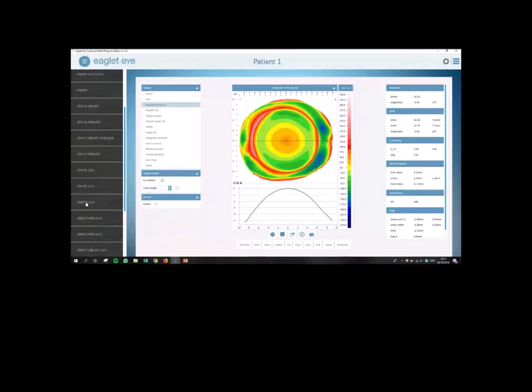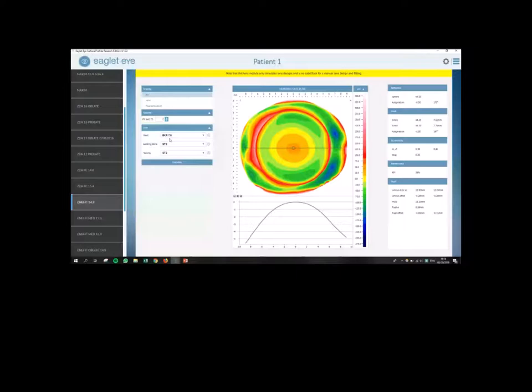You can click on one of the algorithms we have available, which you can see over on the left-hand side. So for instance, in this case, I'm a little bit curious, I want to put a OneFit on there. I just click the OneFit algorithm. If you give it a couple of seconds, it's going to load up the suggestion for the OneFit lens. So right now it's telling you to order a full or a BCR of 8.6.